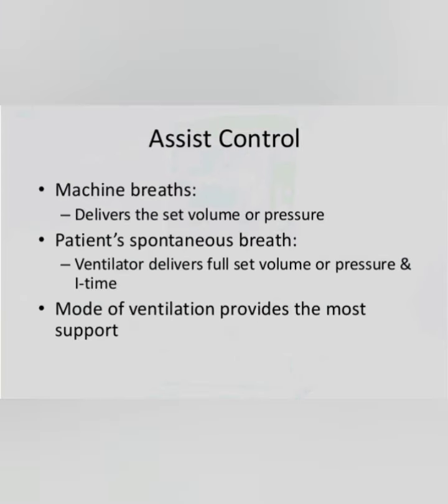Now I would like to talk about the assist control ventilation mode. Here, if the patient does not initiate inspiration, the ventilator automatically delivers the preset rate and tidal volume, ensuring minimum minute ventilation. In assist control mode, the work of breathing is reduced to the amount of inspiration needed to trigger the inspiratory cycle of the machine.